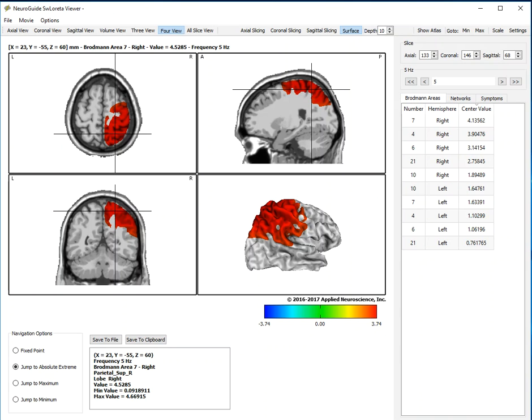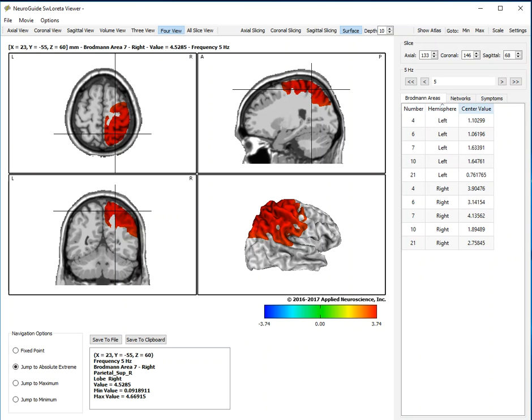Then you can examine the Brodman areas that comprise the anxiety network. You can sort by number, you can sort by hemisphere, you can sort by the strength of the z-scores in the center voxel.